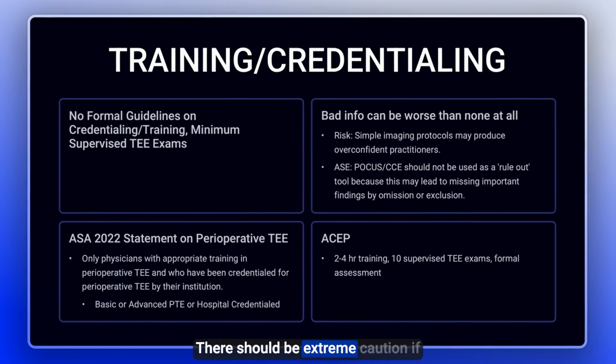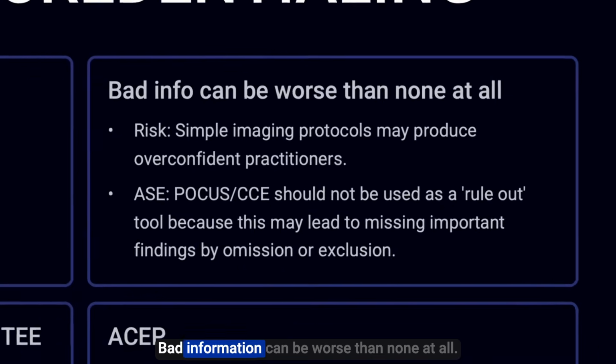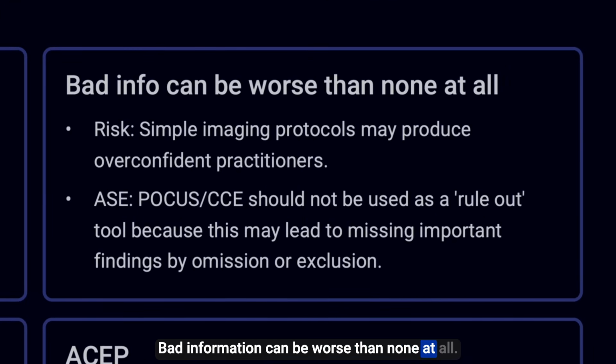There should be extreme caution if someone is not adequately trained to both perform TEE and interpret images. Bad information can be worse than none at all. The risk here is that with these simplified imaging protocols, it can produce overconfident providers.